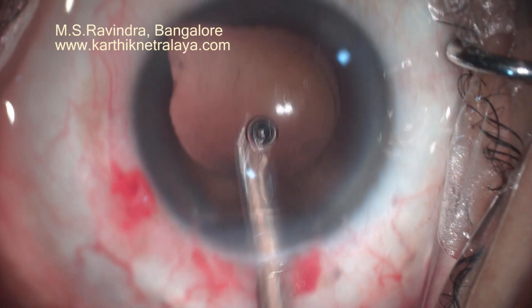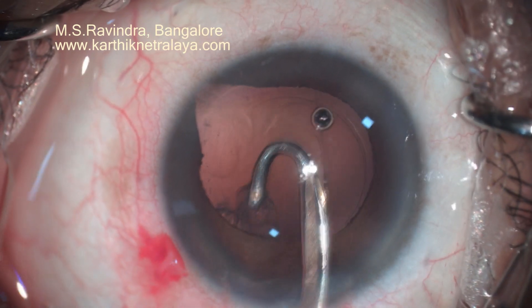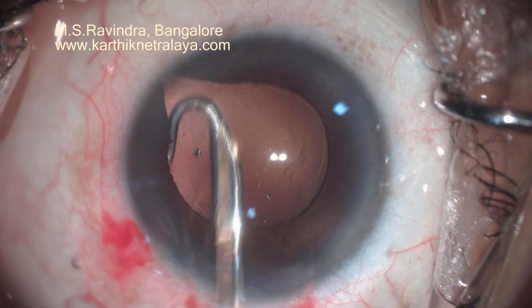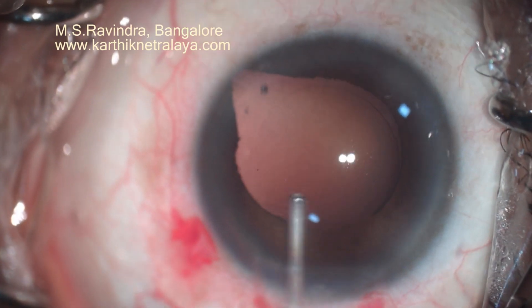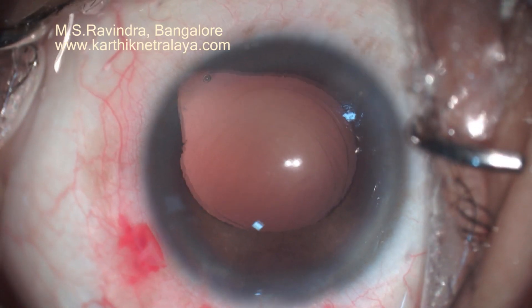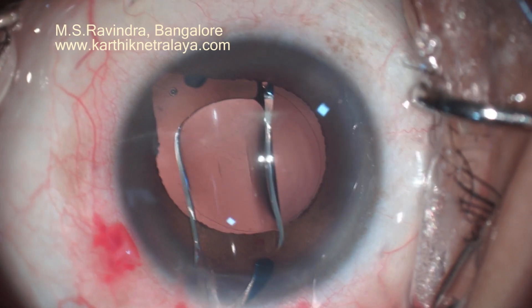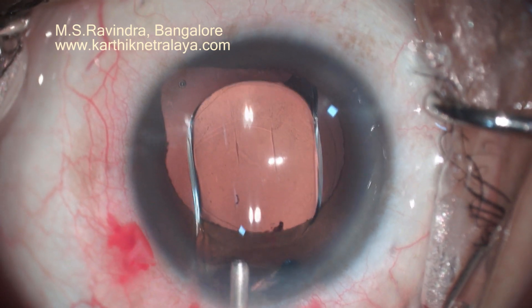Very carefully, the cortex at the coloboma area is aspirated and the area is polished. It will usually have a few adherent spots of opacity and sometimes it will have deficiencies — that is the reason it should be handled at the end. Sometimes vitreous fibrils are seen through a defect in the capsular bag in the coloboma area, where herniation of the capsular bag often occurs.